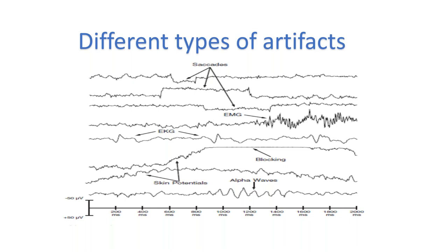Narendra has a comment. He wants to add on to something that Chandan has said. Narendra, are you there? Theoretically, I can say, Chandan, you can block like 30 milliseconds, because we look into cortical evoked potentials only from 50 milliseconds. That is what I am saying theoretically. I do not have experience in this.